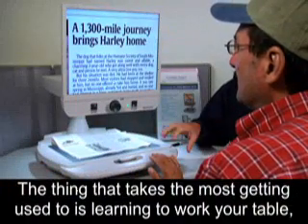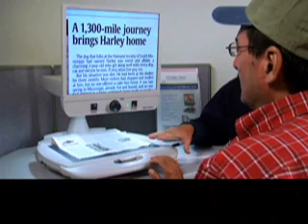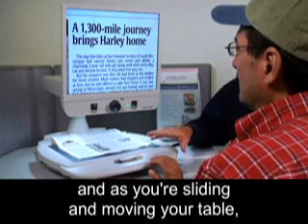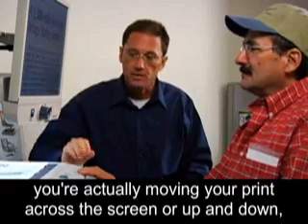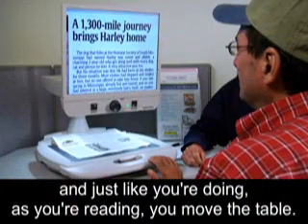The thing that takes the most getting used to is learning to work your table. As you're sliding and moving your table, you're actually moving your print across the screen or up and down. Just like you're doing — as you're reading, you move the table.